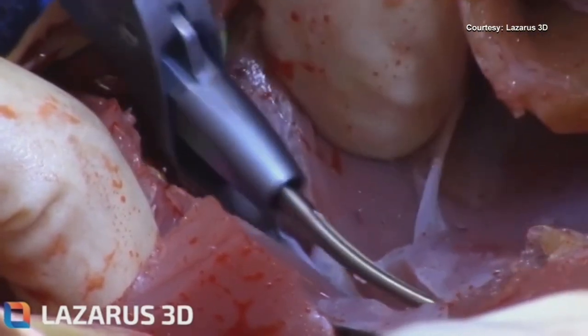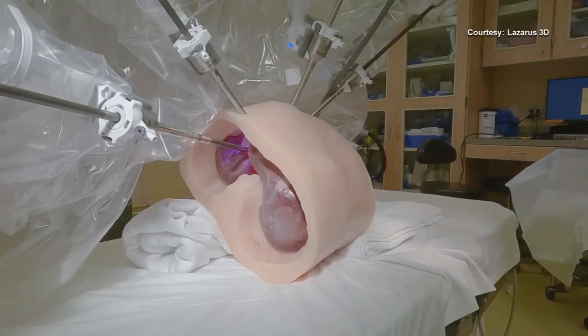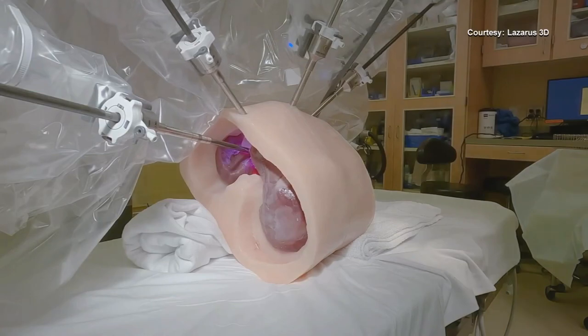She was like, "You're kidding, right?" She thought there had to be a better way. With soft tissue, this was not being addressed because the technology did not exist. So this is why it's revolutionary — they built that technology. They built PRE-SHURE, which stands for Preoperative Surgical Rehearsal.